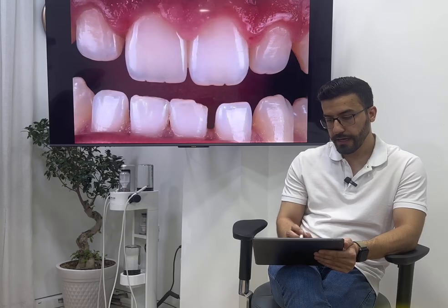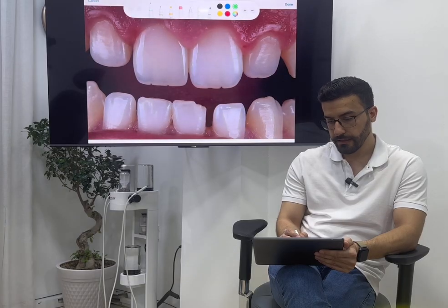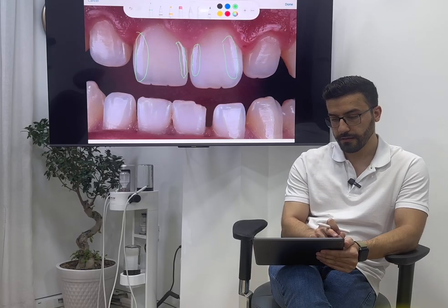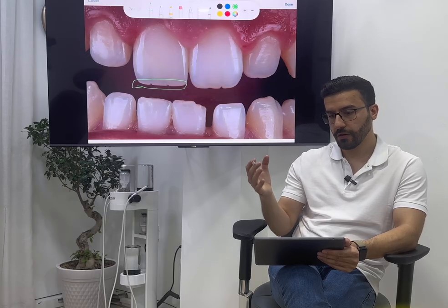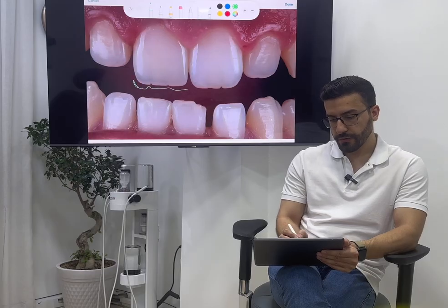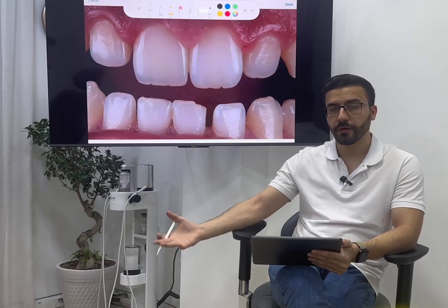As you can see, I have what? I have a beautiful transitional line. These are my transitional lines on the teeth here and here also. So I copied everything. I have a beautiful opacity incisally. So I created my incisal halo also. And as we said, the zigzag also was created. So for a class 4, this is the only thing that we need.